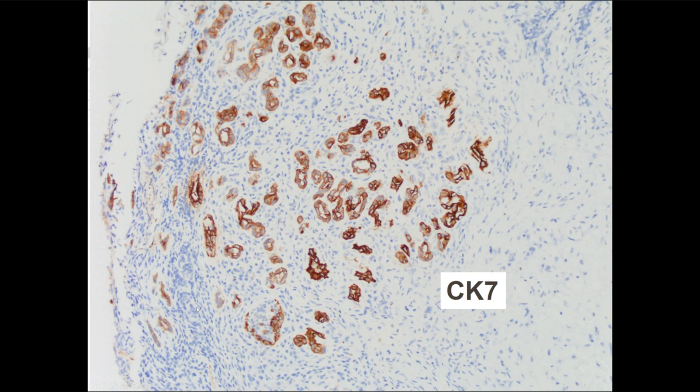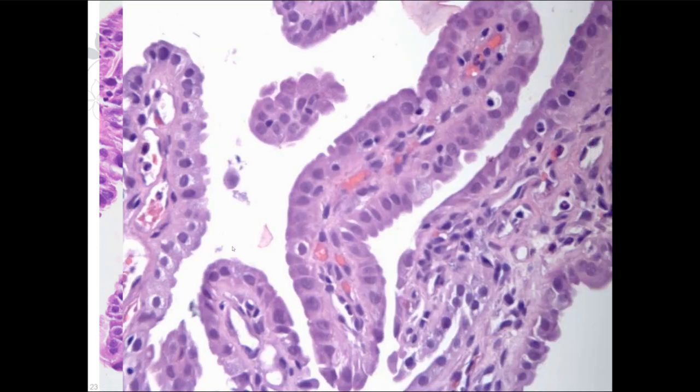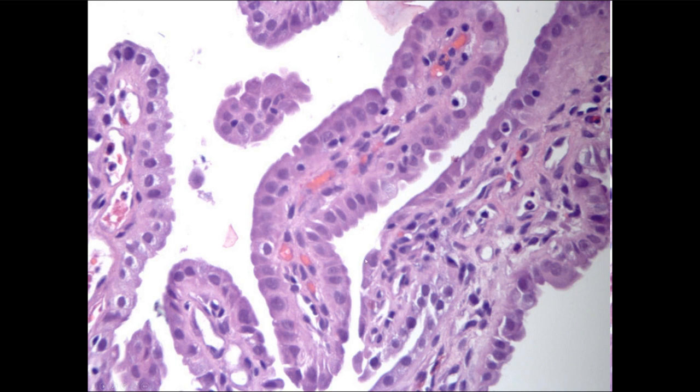So these lesions will stain strongly with CK7. This is an example of a papillary subtype of nephrogenic adenoma. These will also stain with Pax8. These will also stain with AMACR. So another example of a nephrogenic adenoma. The key thing to notice is that there is a single layer here.